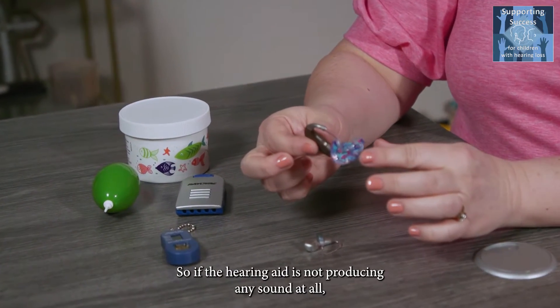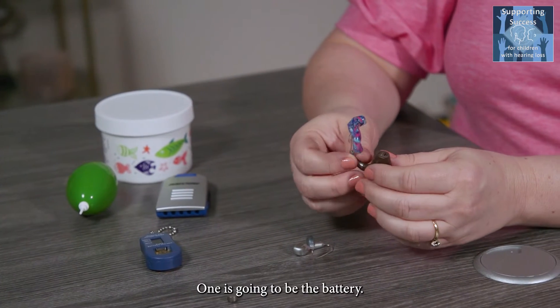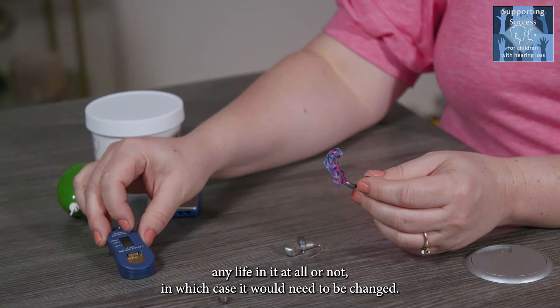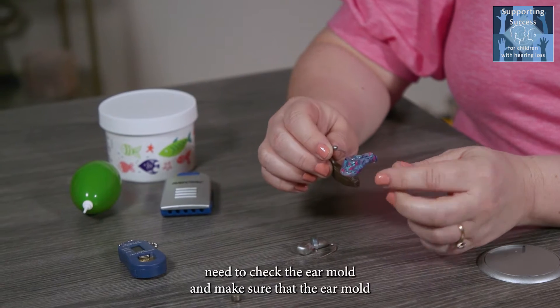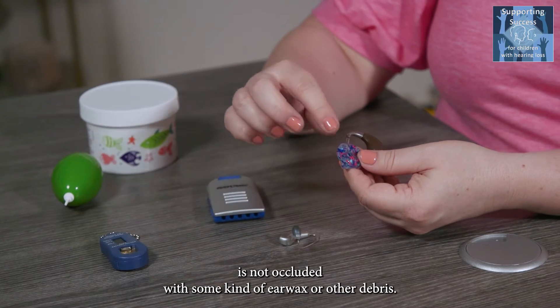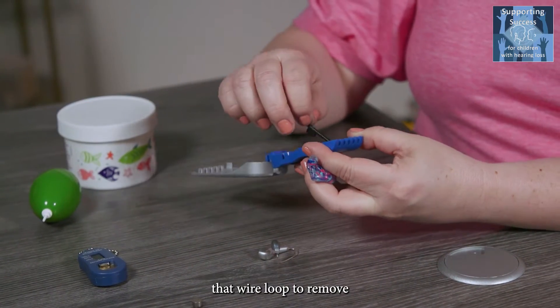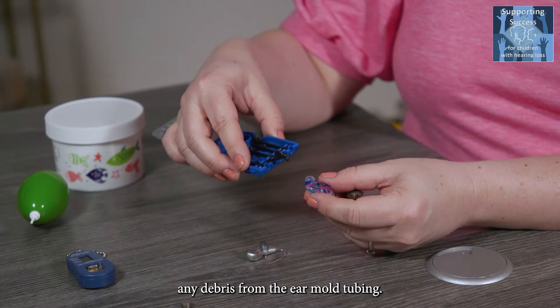If the hearing aid is not producing any sound at all, there are basically two things to check first. One is the battery — you can use your battery checker to see if the battery has any life in it, and if not, it would need to be changed. You also need to check the ear mold and make sure it's not occluded with ear wax or other debris. You have a set of tools, especially that wire loop, to remove any debris from the ear mold tubing.